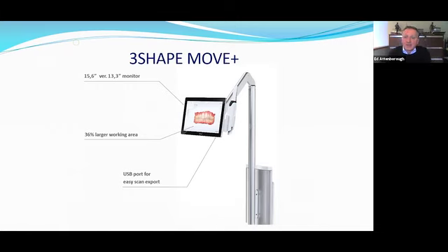I think there's obviously an attraction to using laptops, you know, USB, etc., plugging the things in. But I think you have to ask yourself how practical that would be in terms of sterilization and cross-infection control. The other thing is with laptops, where do you put the laptop? Typically, we see that clients will put the laptop on the cabinetry, and then the wire will be stretching across from the cabinetry to the chair, and that's a kind of trip hazard. You know, a nurse, somebody else could go around there and whip the laptop off the bench, so to speak.